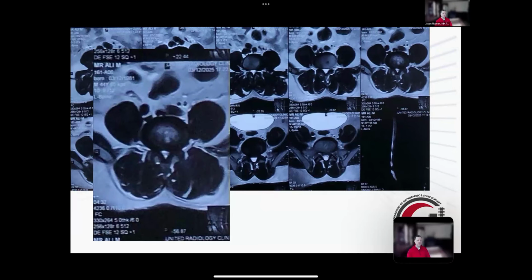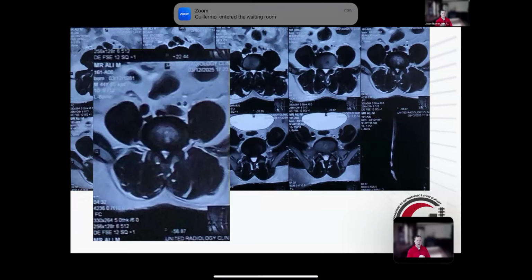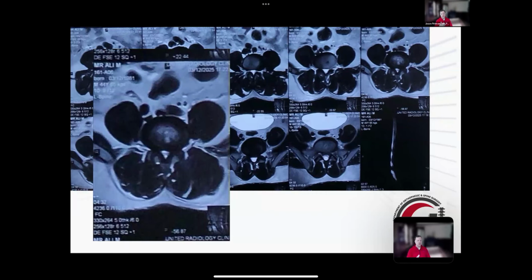And the hope with endoscopy is that you can do more non-fusion surgery, because it opens the door to certain decompressions that with open techniques would require a facetectomy, or things that put you in a fusion pathway. And so the flexibility that endoscopy gives you is hopefully fusion sparing. Once it's fused, there's no going back. You can only keep fusing the next levels, right?